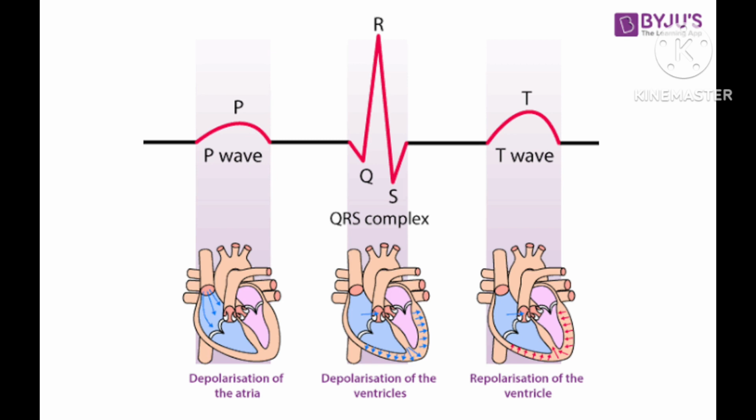A normal ECG makes a specific pattern of 3 recognized waves in a cardiac cycle. Many types of waves are there. Cardiac means related to the heart, and cycle means some things are going in repetition.